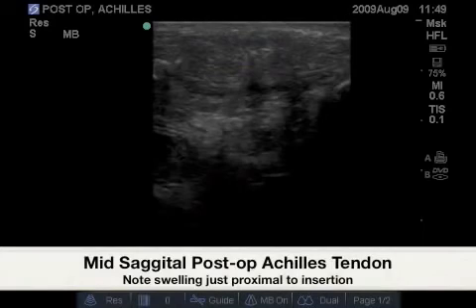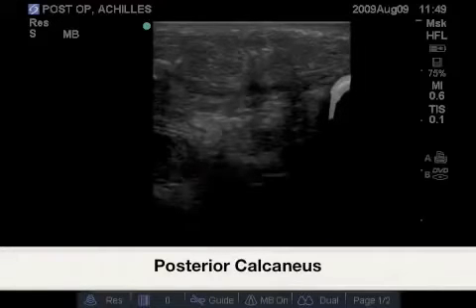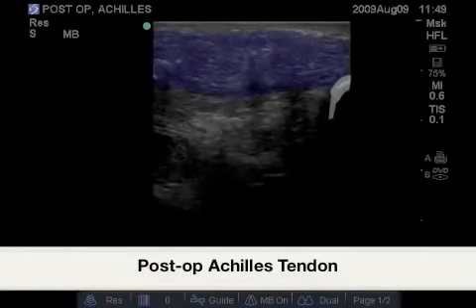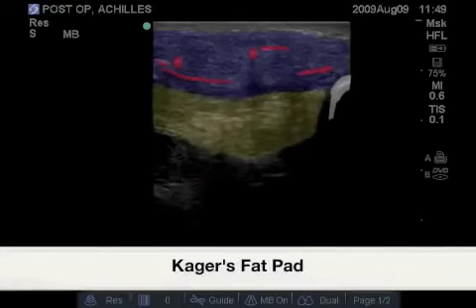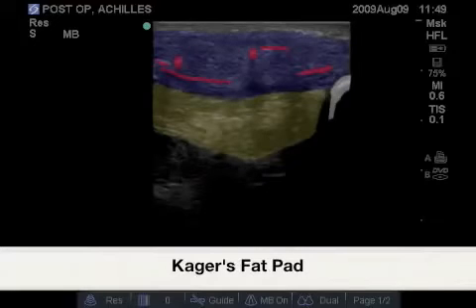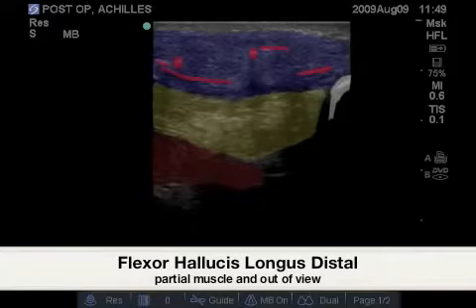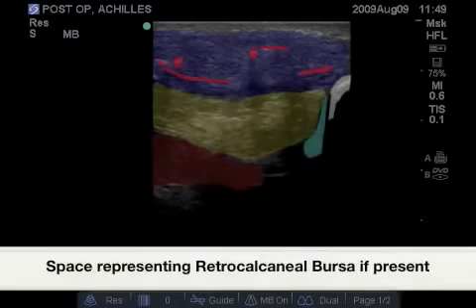Here we will see images of the normal intact post-operative Achilles tendon. Highlighted here is the posterior calcaneus in the mid-sagittal plane. Highlighted here in blue is the mid-sagittal Achilles tendon. Highlighted in red are the multiple sutures present throughout this post-operative Achilles tendon. The Kager's fat pad is compressed anteriorly, making it appear hyperechoic. Deep to the fat pad is the flexor hallucis longus muscle before it becomes tendon. The light blue highlighted area represents where we would find a retrocalcaneal bursa.